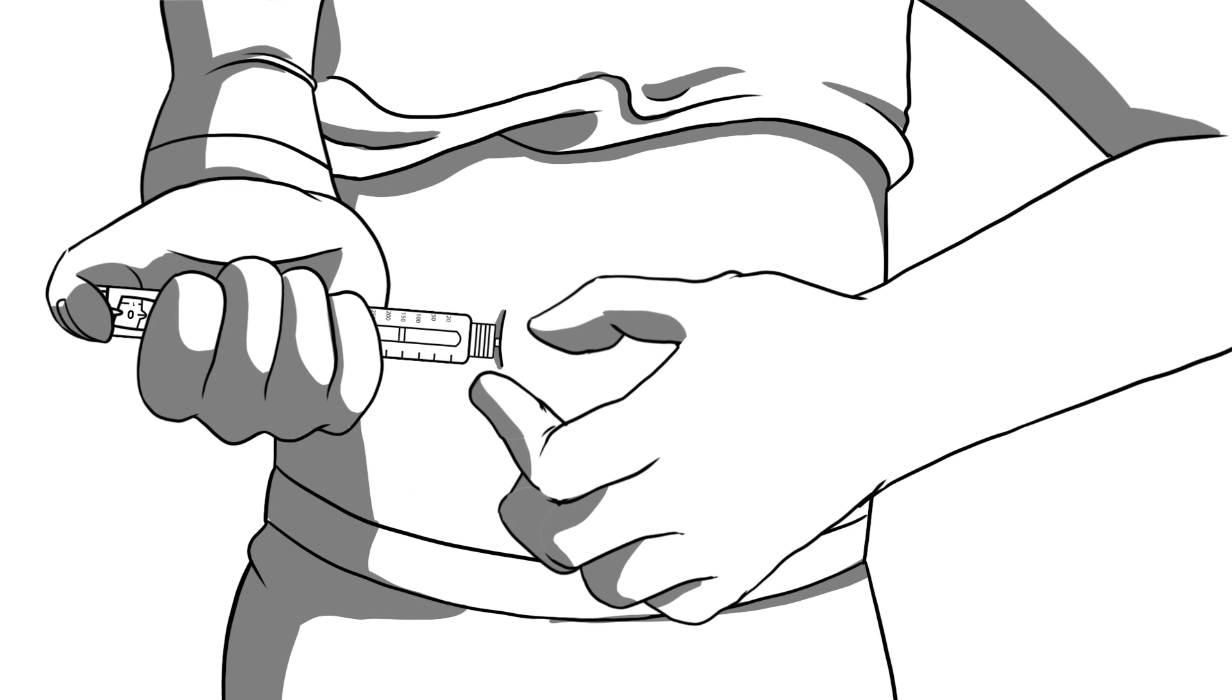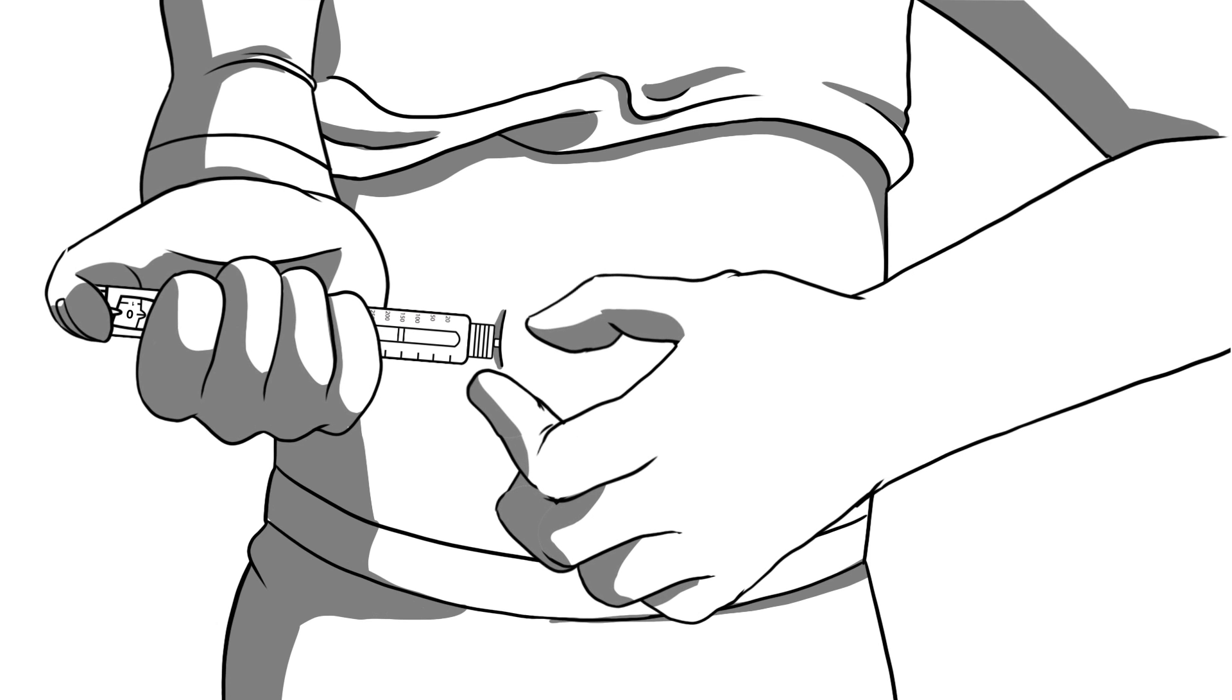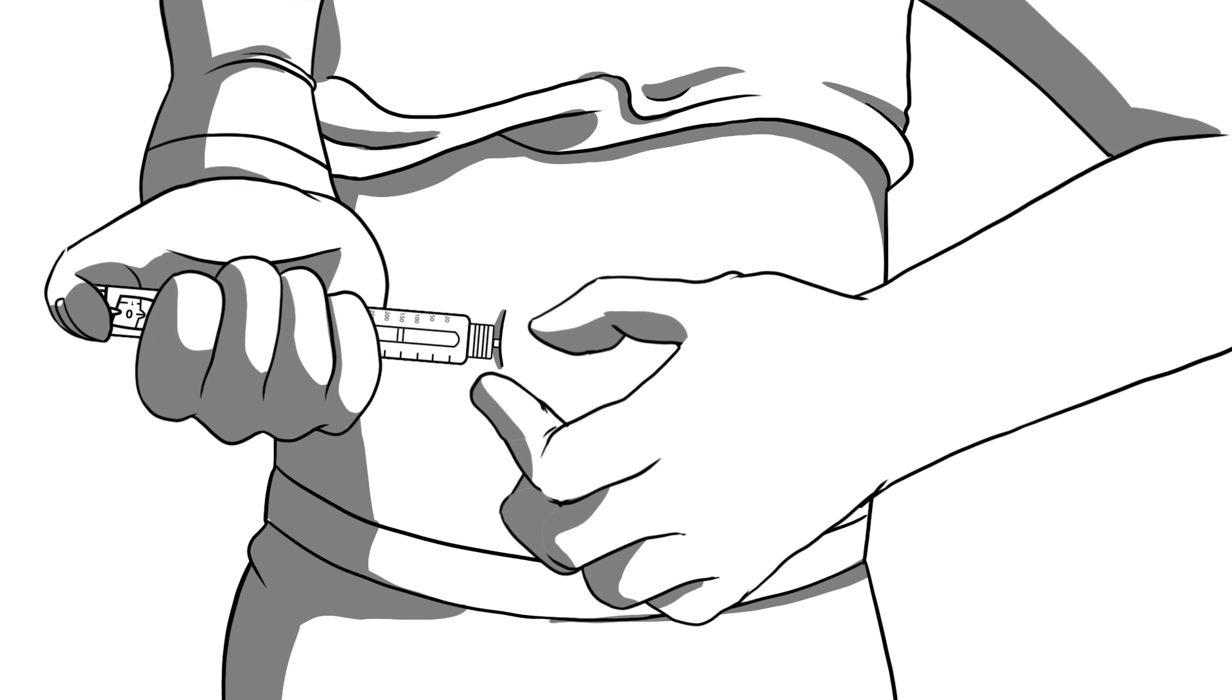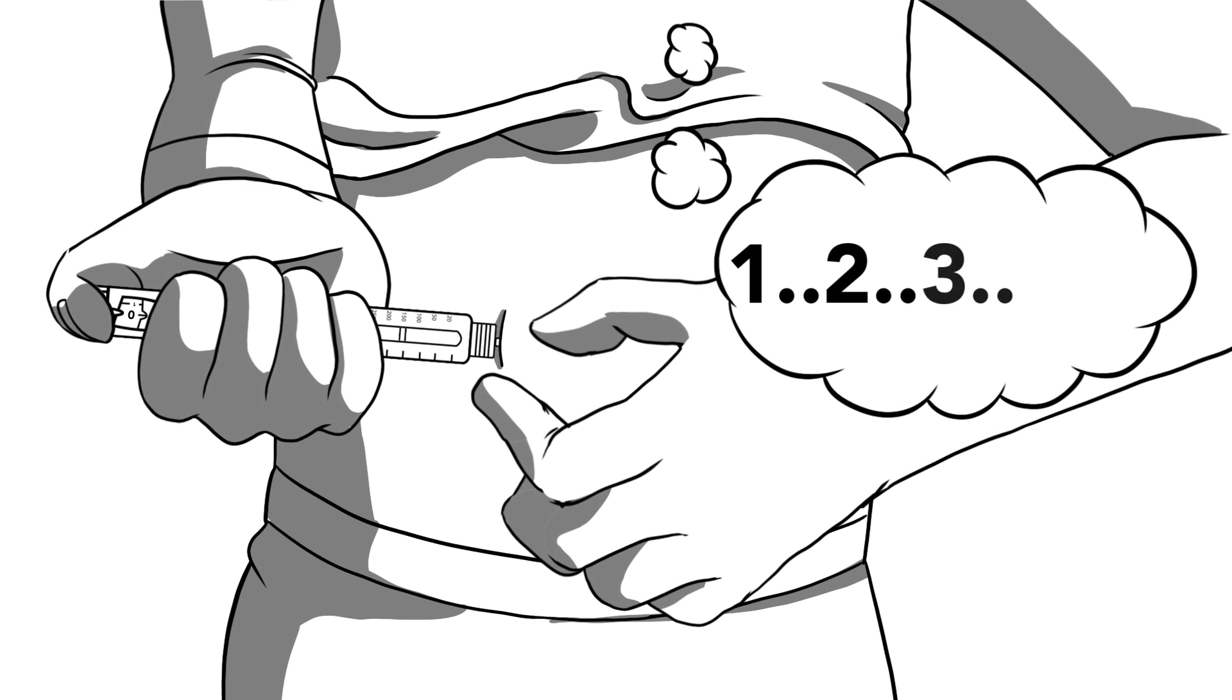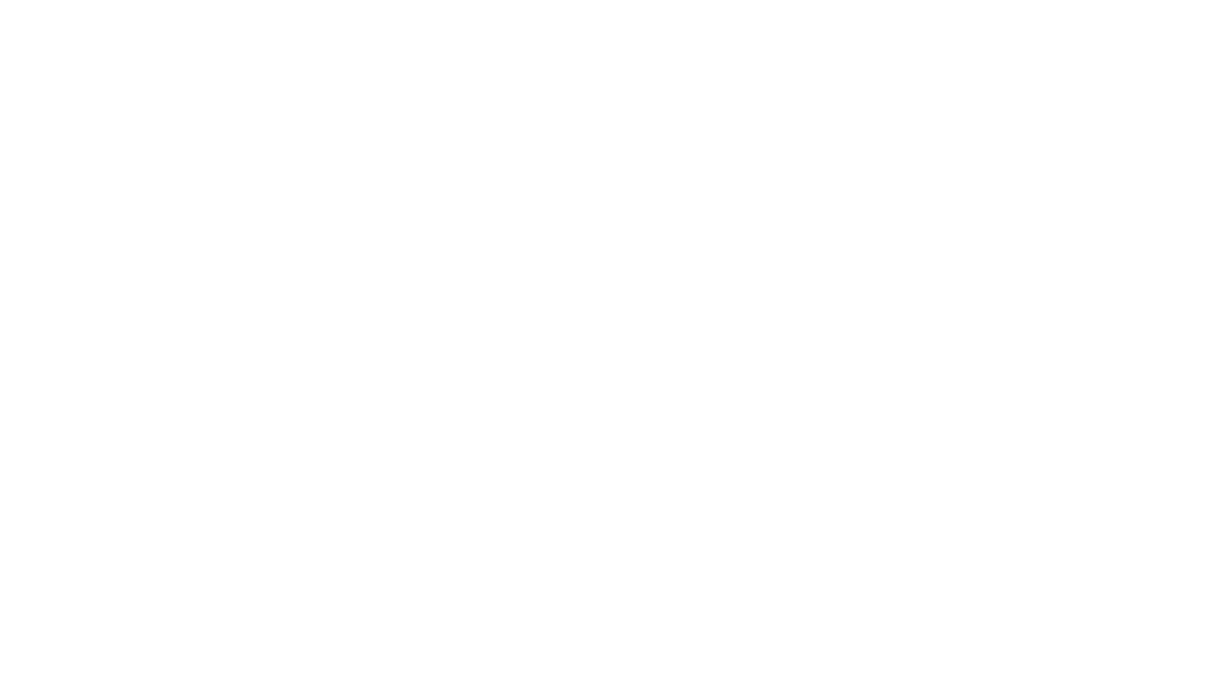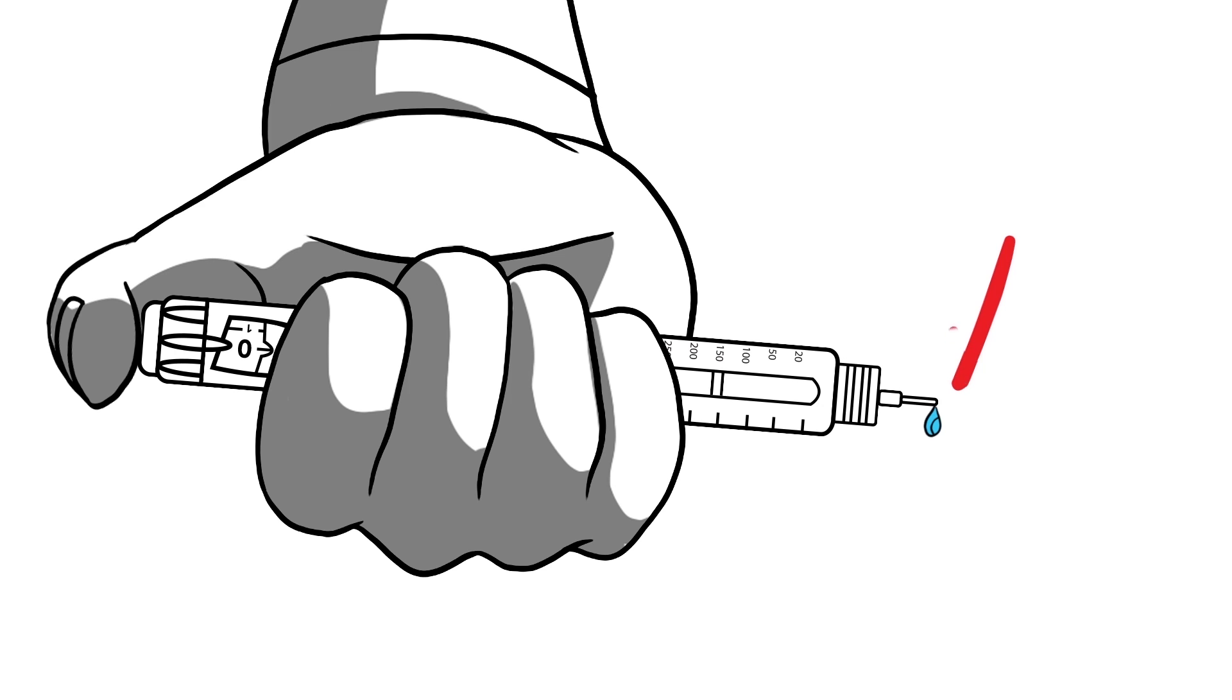Once the button is pressed down and the indicator reads zero, count to five slowly. When five seconds is up, then you can pull out the needle. Once removed from the skin, it is normal to see a small drop of insulin still on the tip of the needle.